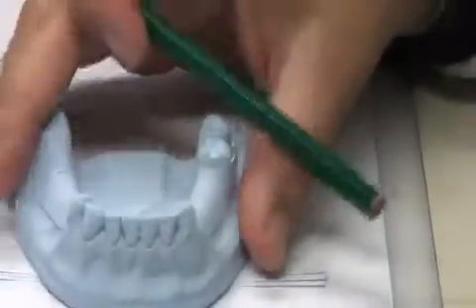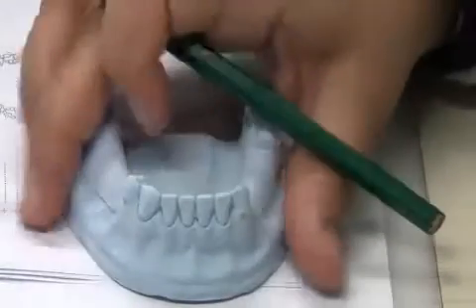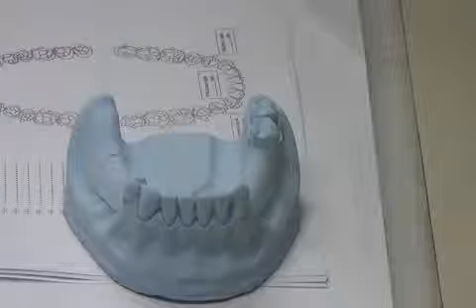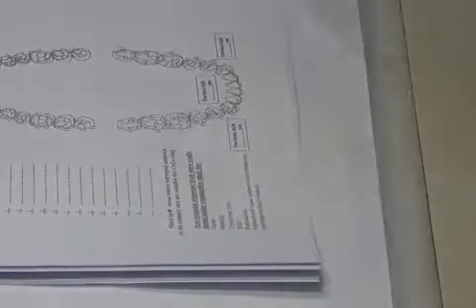The cast is solid. It has one color. Can the technician see mobility here? On the cast, can you see mobility? Can you see bleeding and probing? Can you see fillings, especially if they are well done? So I need to scan, especially the abutment teeth, very well.